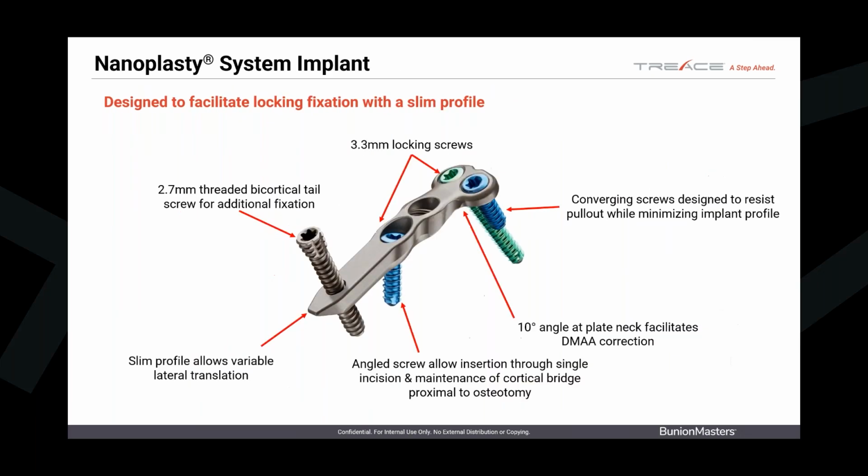So this is the plate. The plate continues to change based on our needs of strength and covering larger patients and correction. But the jig is where the magic is. The plate is where the magic stays. And so the plate holds everything into position once you get it there. So you feel comfortable as a surgeon, you put it into the position, and then the plate holds it there.